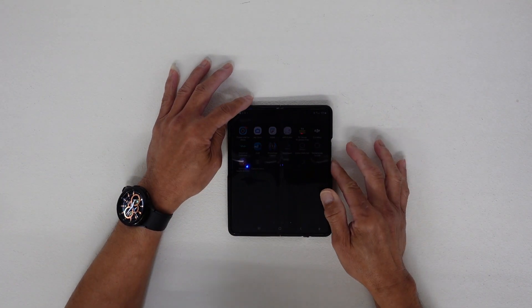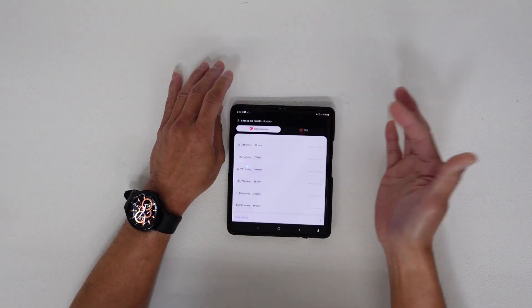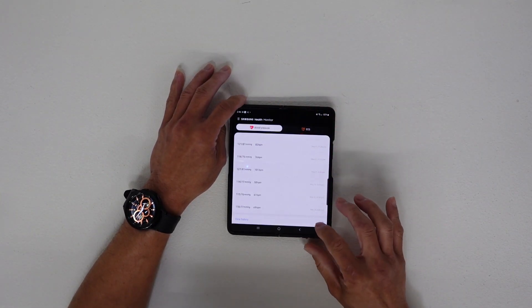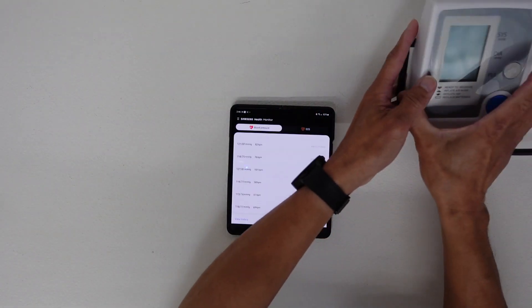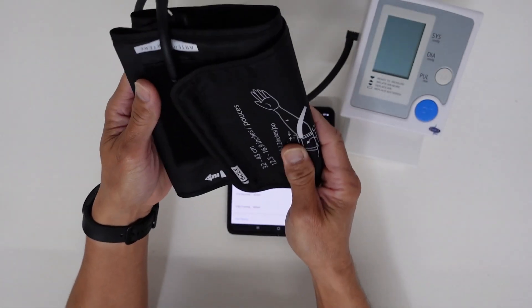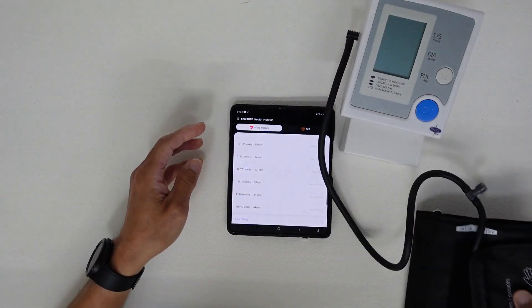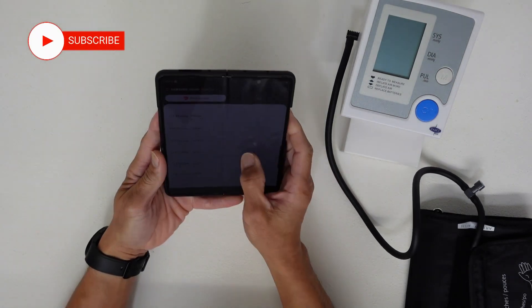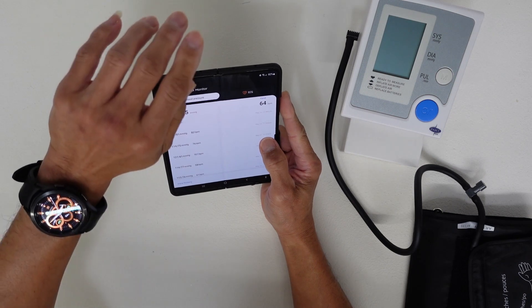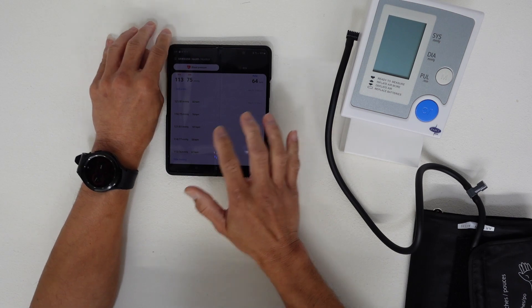If you are a first-time user of the blood pressure monitor and ECG, you have to calibrate it first using a blood pressure cuff on your arm — that's the accurate one. To get your Galaxy Watch 4 blood pressure monitor to be accurate, you have to calibrate it through the Samsung Health Monitor app.